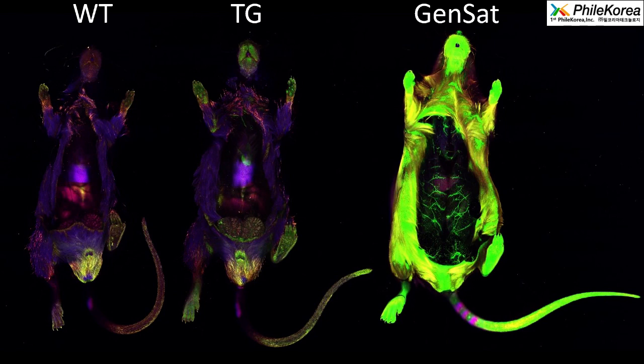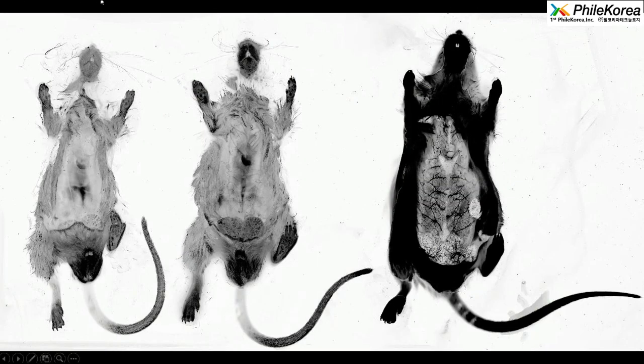I can show you this also in black and white. So in black and white we see the contrast even better, so we can distinguish even better. So you see here no GFP, a bit GFP, and a lot.